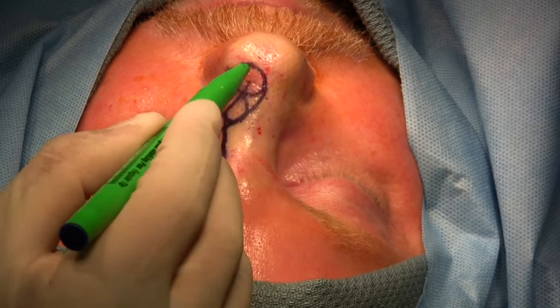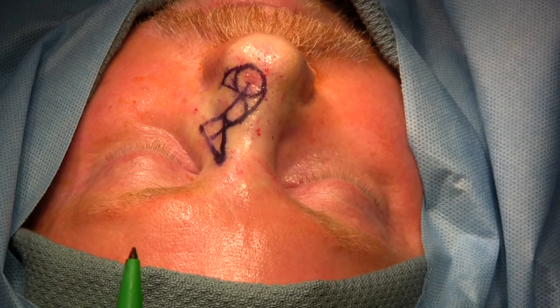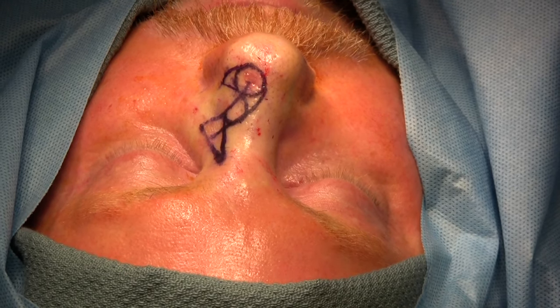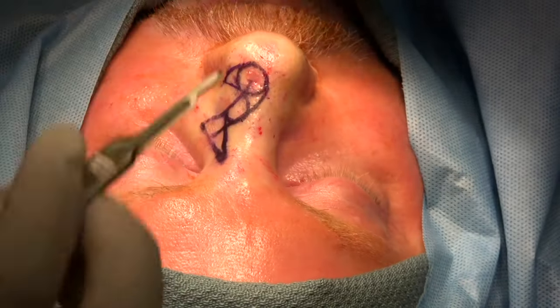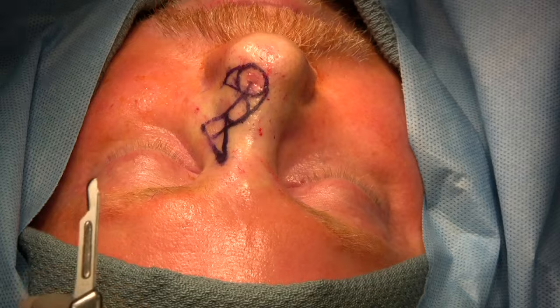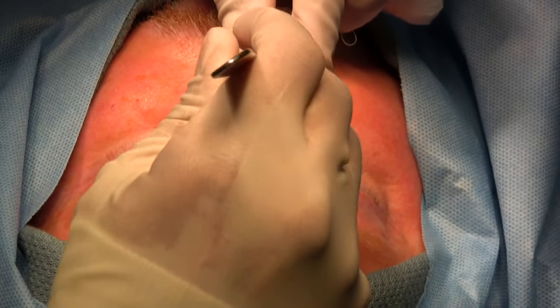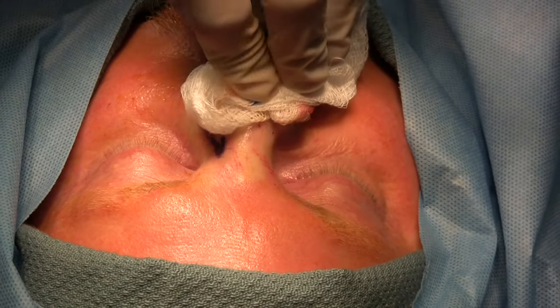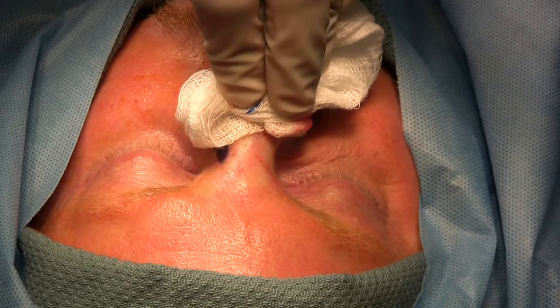We will start by removing our basal cell carcinoma defect, orienting it with sutures, and then we will wait for the histopathological confirmation of negative margins. It is very important to bevel your incision outwards to help evert the edges and also catch any outlying basal cell cancer. At this point, we will mark the sutures to orient the specimen.